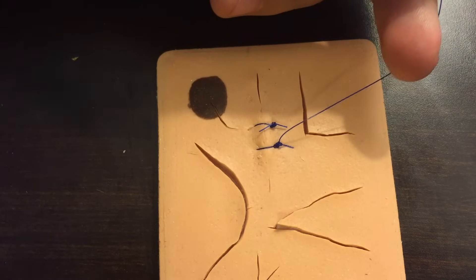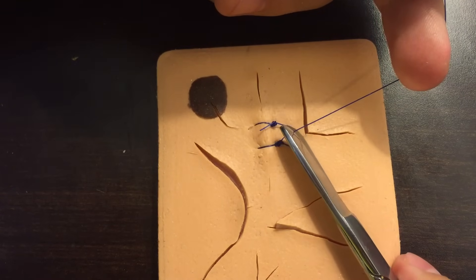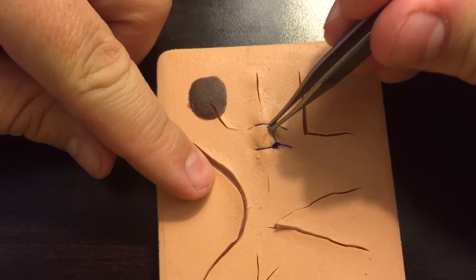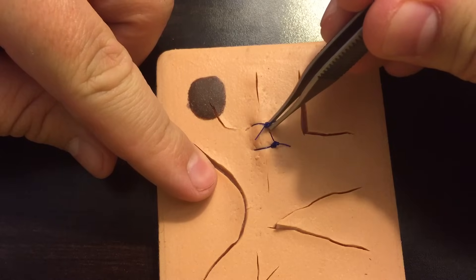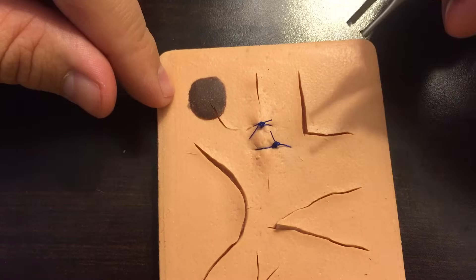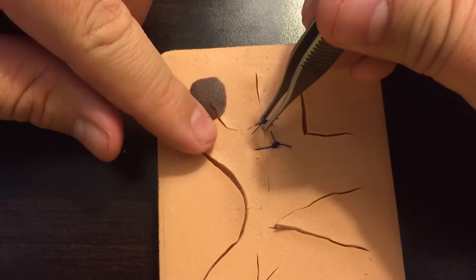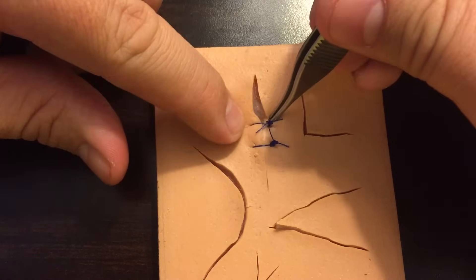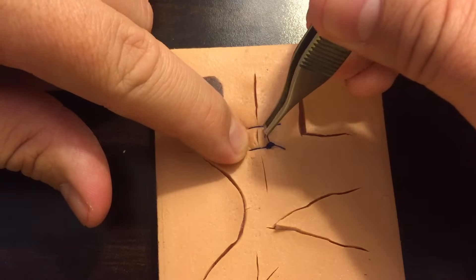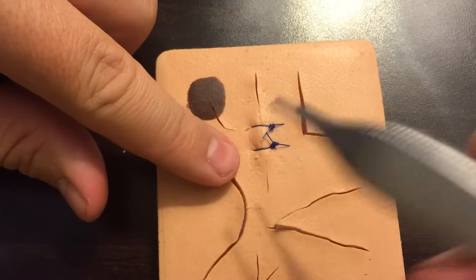One important point: when you're done suturing, all of your knots should be over on one side of the laceration rather than in the middle. If the knot sits right on the skin edges, it will prevent good healing right there. Make sure you're pulling the knot off to the side so the skin edges are not being pushed on by the knot.